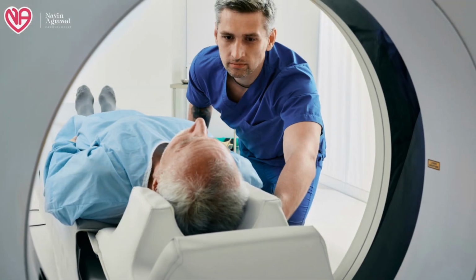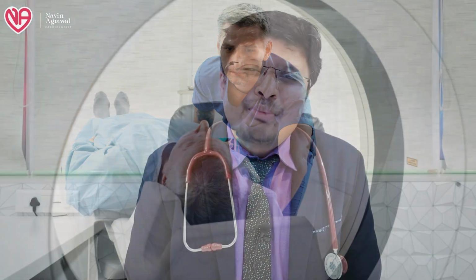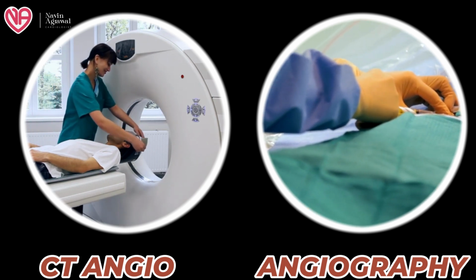Although CT calcium scoring is a relatively reliable tool, in cases where calcification is not much, and especially in very young patients who are more likely to have clots in their coronary arteries and less calcified, more atherosclerotic blockages, the CT coronary calcium scoring values can be completely wrong, and we may or may not be able to judge whether the patient is having significant blockage or not. And in this case, the angiography, the CT coronary angio or the conventional catheter angio, gives much better results as compared to a calcium scoring.